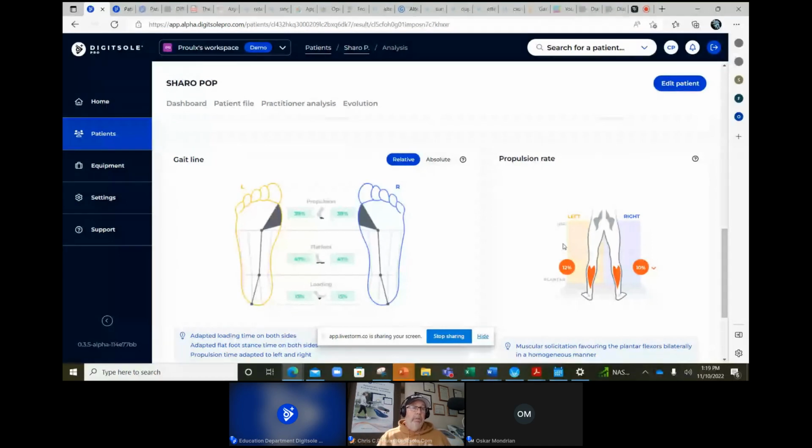Okay. And so, what would typically happen for someone who's mostly normal is they should be fairly normal in terms of the ratio, and possibly even use more of the hip flexors to bring that leg forward, because they're not going through large ranges of motion when they're walking that slow, because their step and stride length are actually shortened. But we see here that she's using a strategy where she's using a lot of her plantar flexors.